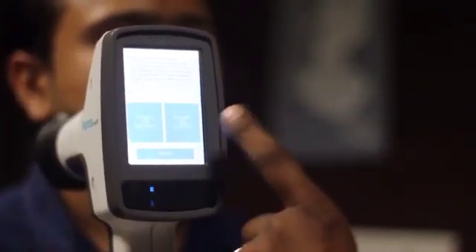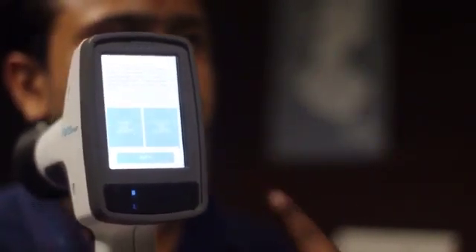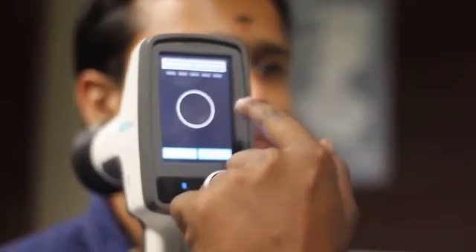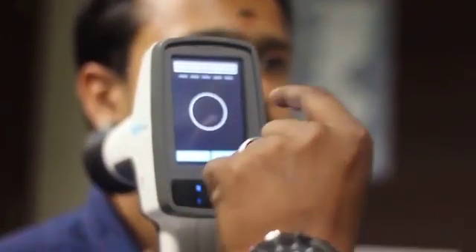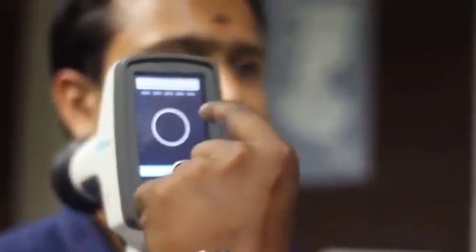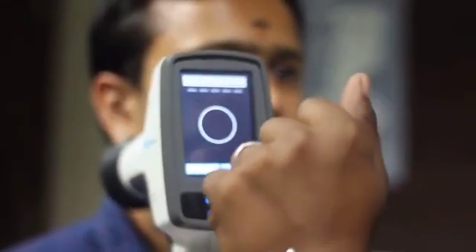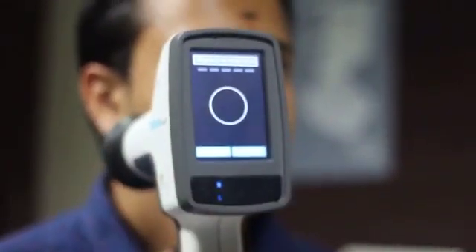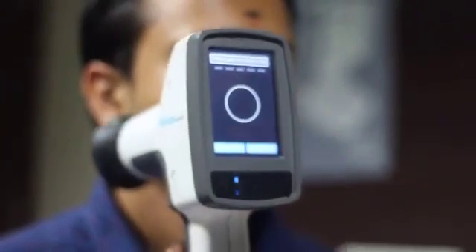I would like to go for the first right option. After pressing the right option, we have a live mode. In the live mode, we have a circular grid. The circular grid helps us to align with the patient's pupil. Now I will show the demo of how to align the circular grid with the patient's pupils.